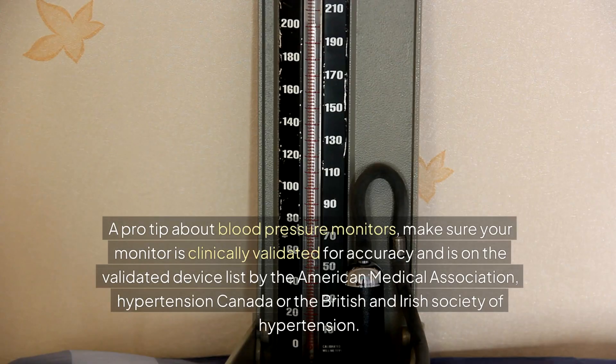A pro tip about blood pressure monitors: make sure your monitor is clinically validated for accuracy and is on the validated device list by the American Medical Association, Hypertension Canada, or the British and Irish Society of Hypertension.